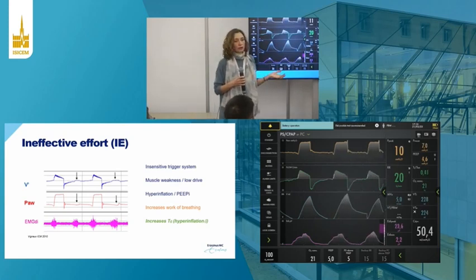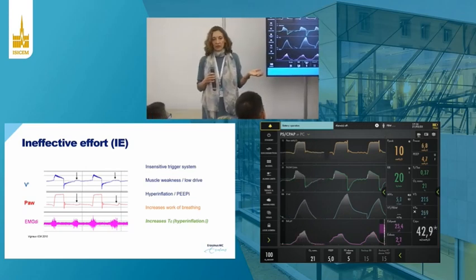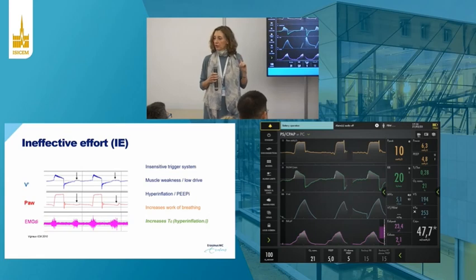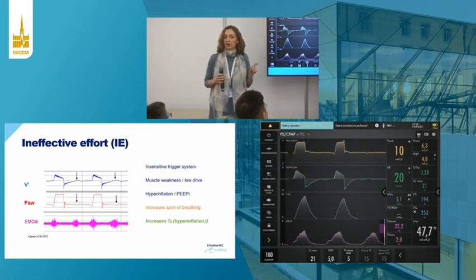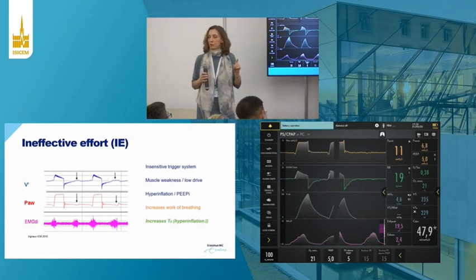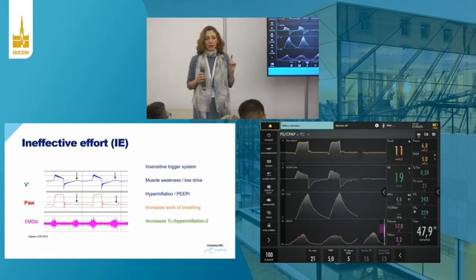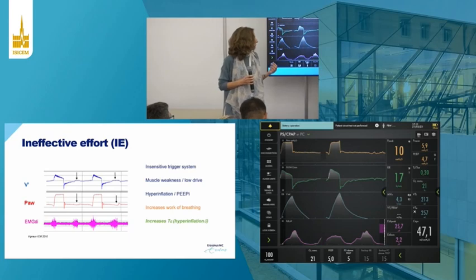And another solution, if the patient is very sedated, you may obviously need to decrease sedation. And also remember that metabolic alkalosis, which happens often when we de-resuscitate the patient, is a cause of low drive. If the patient has a pH of 7.47, for example, he's not really motivated to breathe. So you need to correct that.